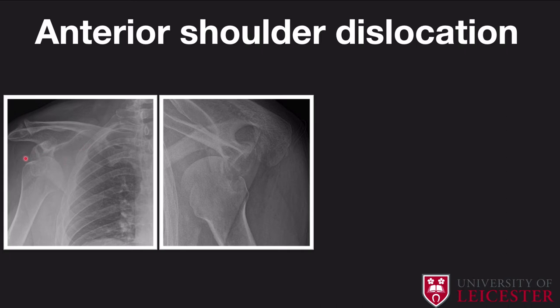In anterior shoulder dislocations, you tend to get a fracture of the inferior glenoid. On the axial view, you can see the acromion, coracoid process, and acromioclavicular joint. The humeral head — which should be articulating with the glenoid — has moved anteriorly. We know it's anterior because the acromion is the most posterior structure. The humeral head is now impacted in front of the glenoid, resulting in a Hill-Sachs deformity. Combined with the glenoid fracture, you get a bony Bankart deformity as well. This is your classical anterior shoulder dislocation — the patient will need to be relocated.